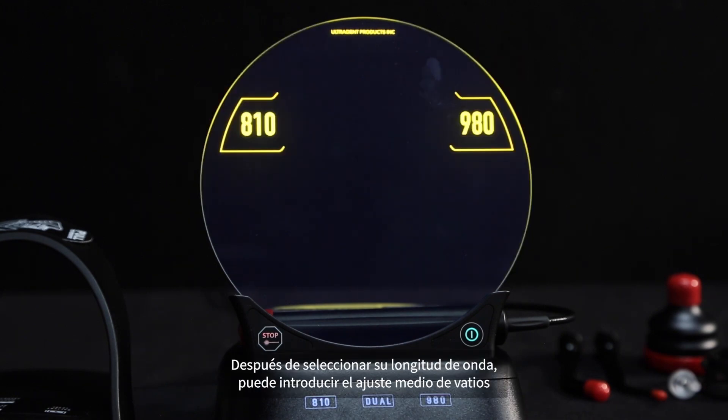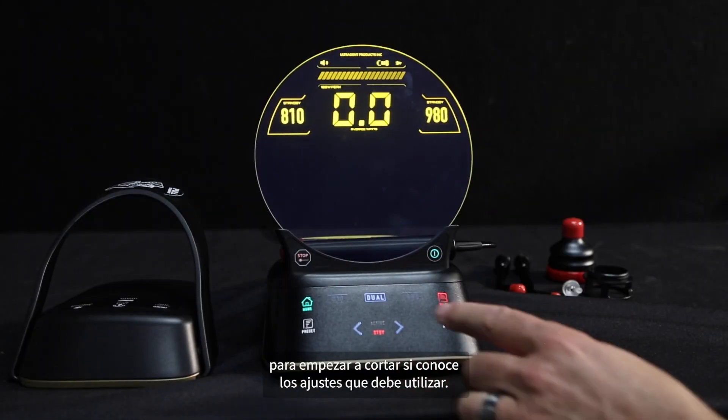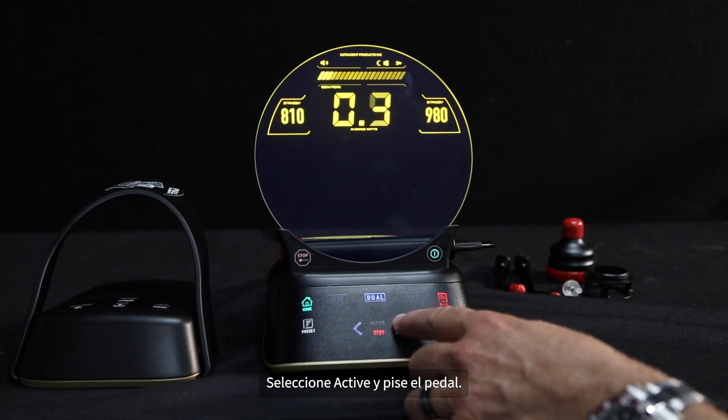After selecting your wavelength, you can input the average watt setting to start cutting if you know the settings you need to use. Select active, then depress the foot pedal.